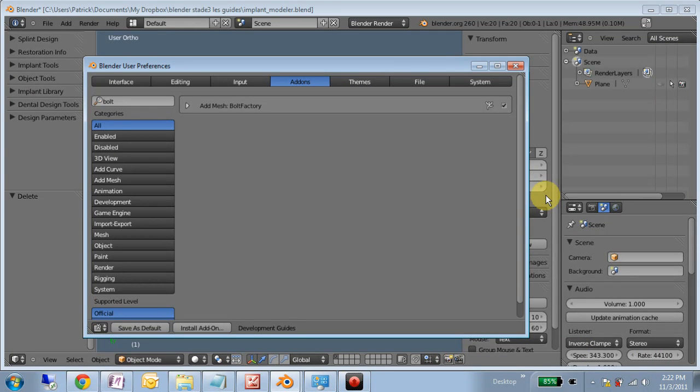This is part one of the implant modeling tutorial. I'm going to start off with a very simple, essentially a cylinder and some very basic anatomical features of an implant, and then we'll come back in part two and we'll actually model the threads and a little more complex modeling. We will not get into the internal connections.